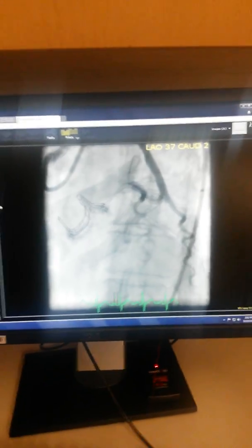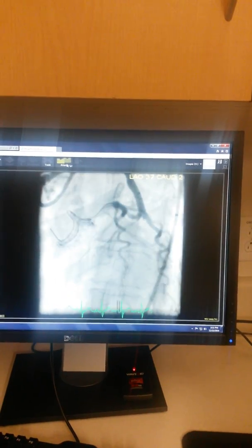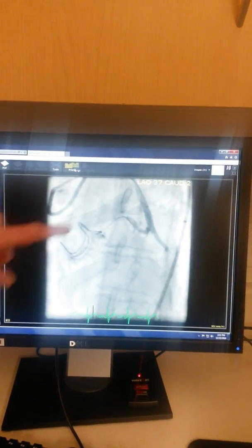So now let me show you. We have our landmarks, and what we're going to do is base the placement of the stent on our landmarks — not what we see angiographically, not where we see the contrast.